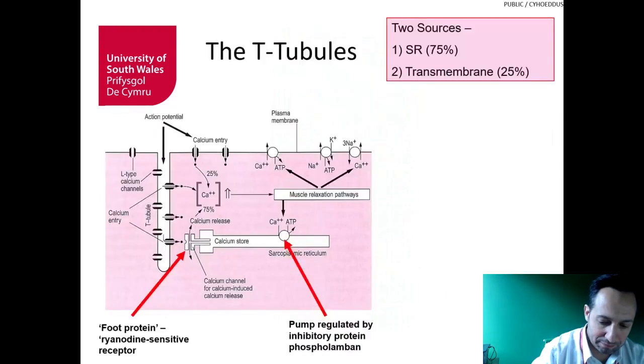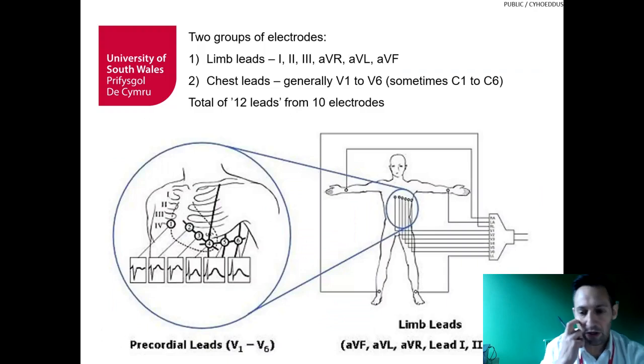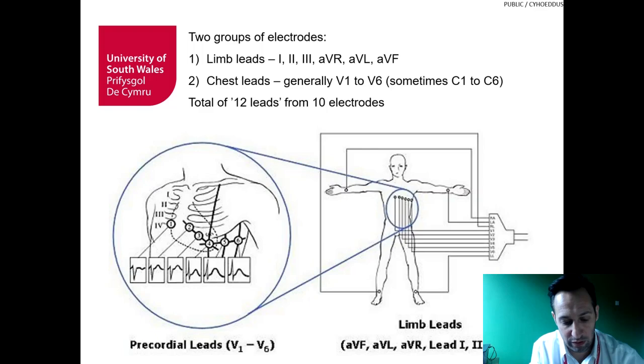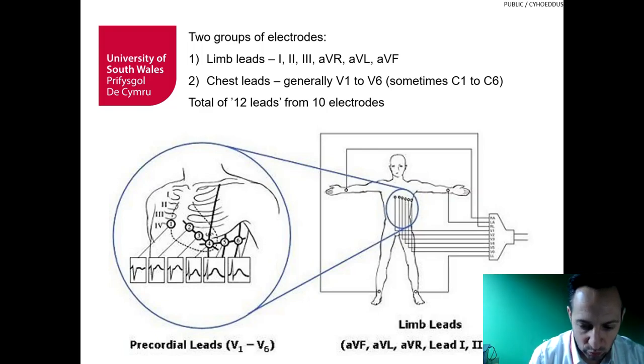Alright. Now, where do I want to take you next? Let's have a little look here. So you should have done a session before you do a live session with me with Chris and or Trevor, where you've placed ECG electrodes either on yourself or one of your classmates. I just want to double check so that I can be confident that I've said to you what everything's doing. Okay, so we've got, as it says on screen, these limb leads.